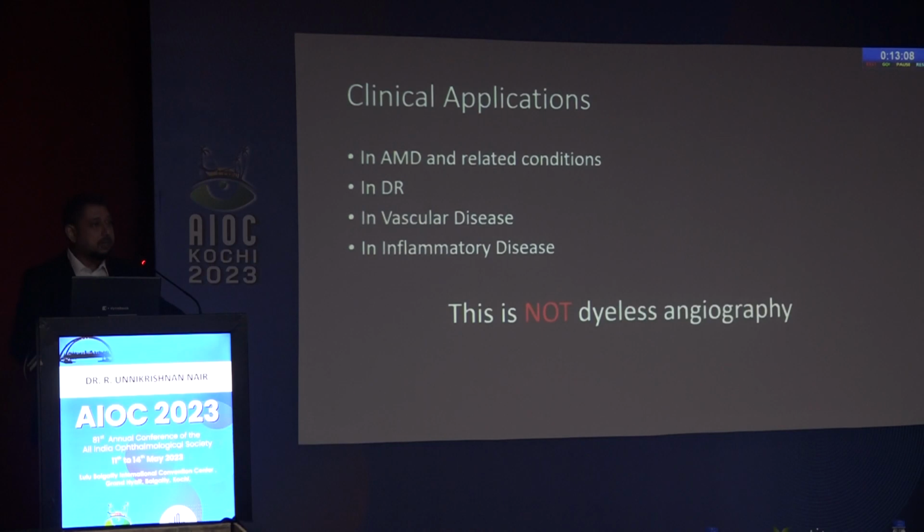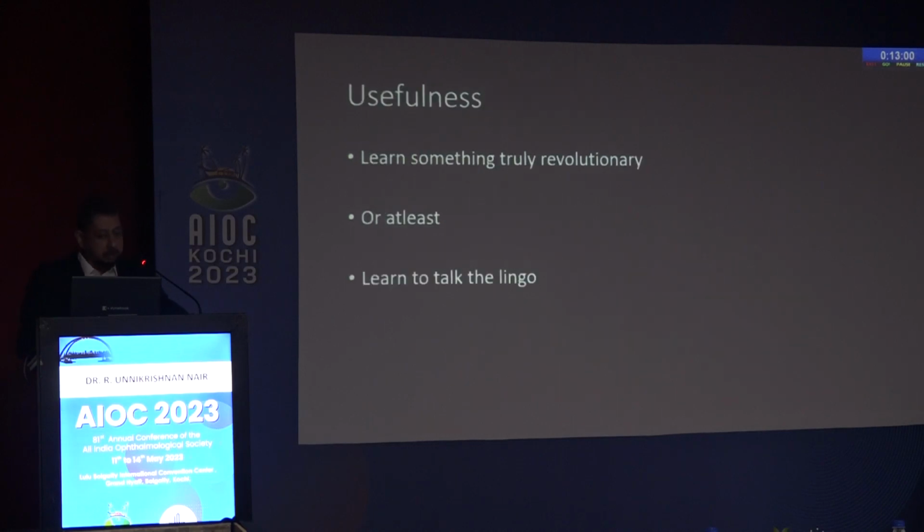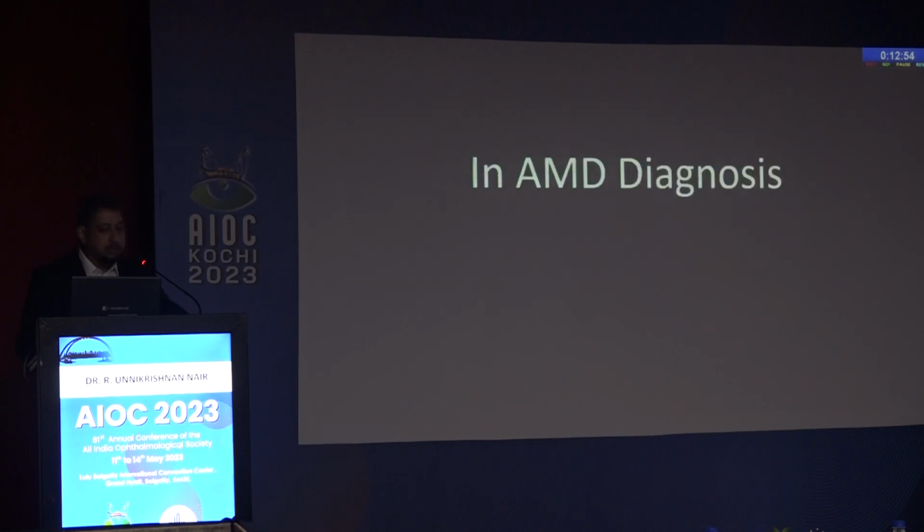And on the clinical applications, we just have to say that this is not dye-less angiography. That's the first thing we have to get into. The whole new brilliant concepts of diagnosis. So today we'll either learn something truly revolutionary or we'll learn how to talk like a retinal surgeon.